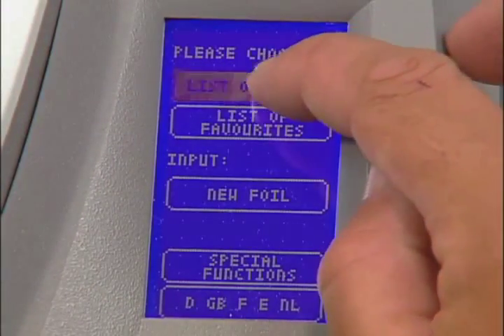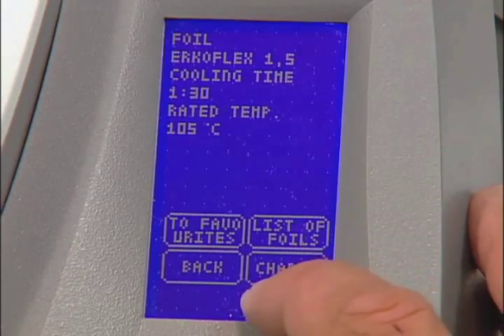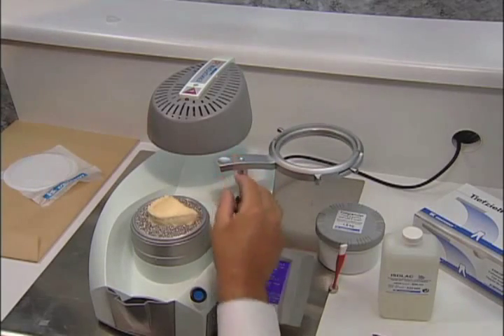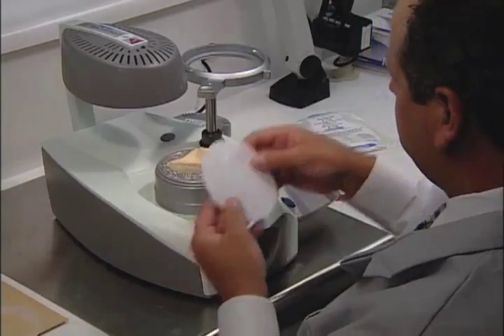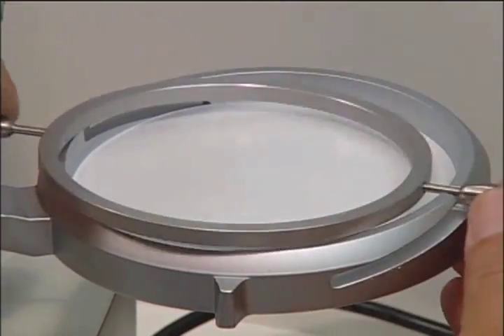Use the List of Foils button to choose the correct foil or disc. For this example, we are using the ErkoFlex 1.5 mm foil. Press Continue. Turn the foil reception ring to the right, then remove the foil securing ring. Put in the correct disk or foil and reattach the foil securing ring.